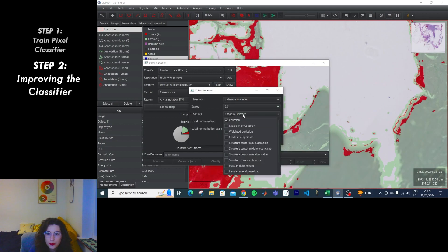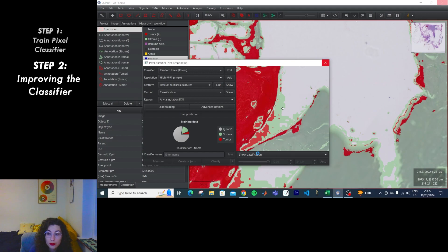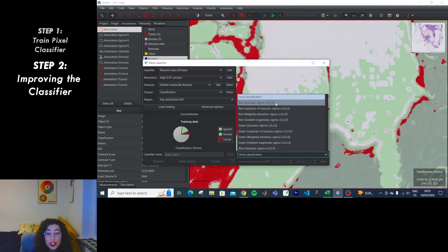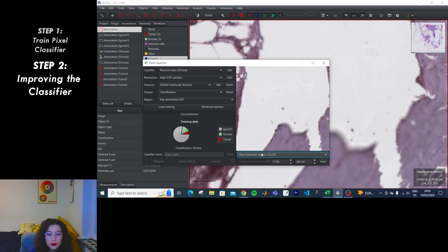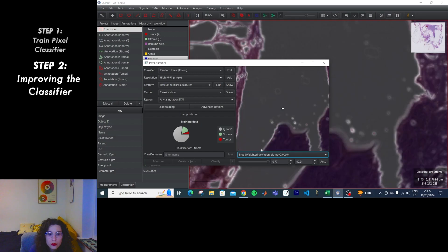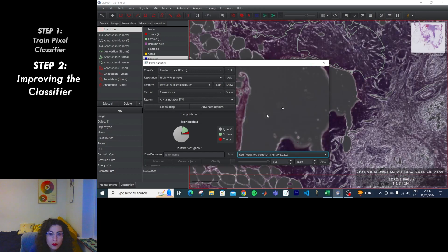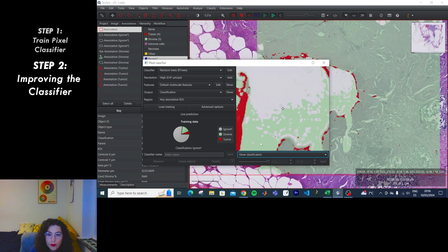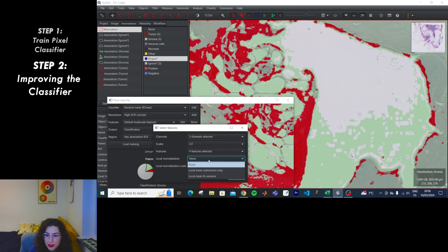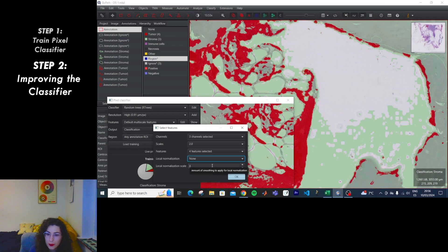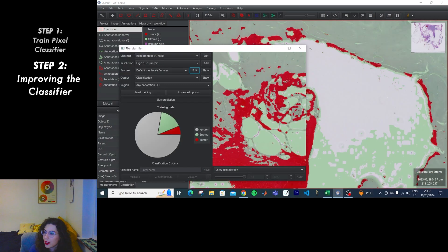Let's include three more features. Now we can see it — for each channel as well. I don't think this one's very helpful, but this one might be. We can also change the normalization scale — though apparently you're not advised to use that. There are tips on the usefulness of features — it's very clear that for each task you should use different features, which makes sense. Apparently we should approach this with a 'less is more' view.